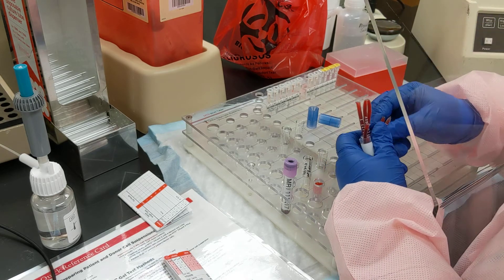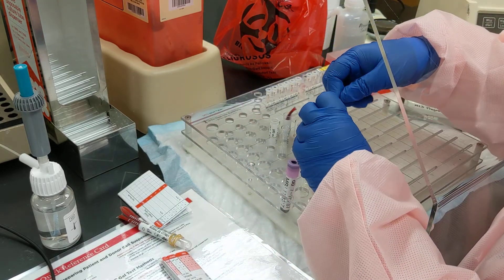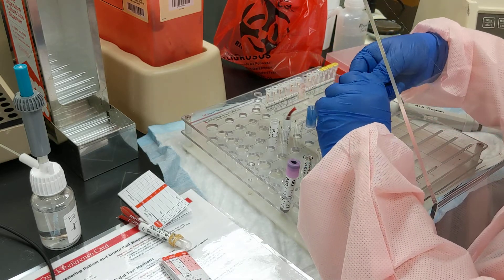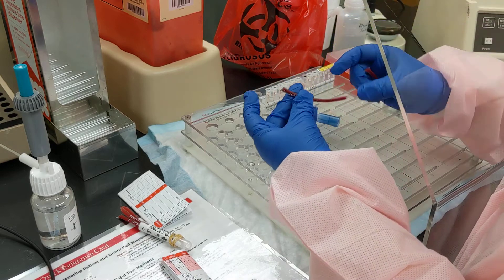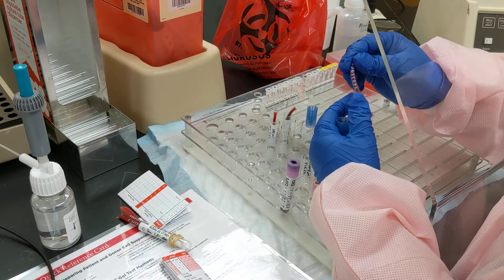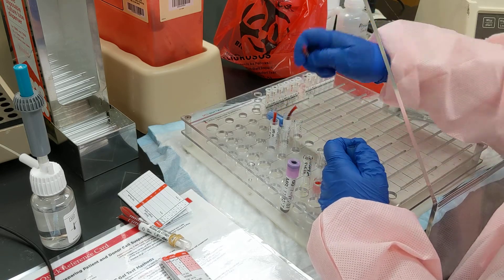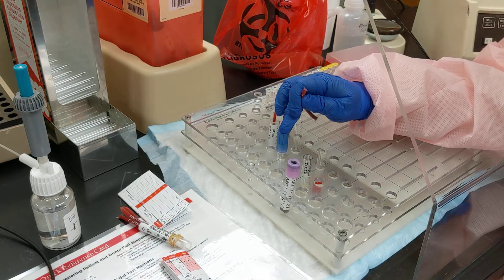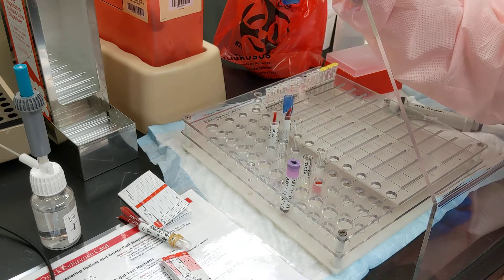We're going to take one of the segments — you can twist it if you're behind a shield. There have been times when these burst loose and spray, so if you're behind a shield, you just grasp it and twist it. It comes apart. You want to make sure the red cells go all the way to one end. Then you set the device on top of the tube, put the end down in, and squeeze. Then you put this in the sharps container.